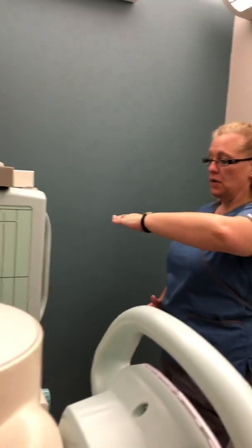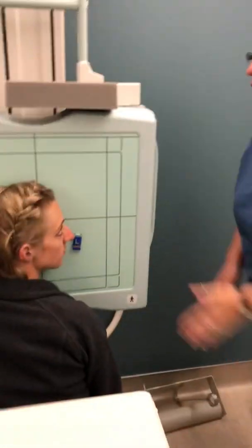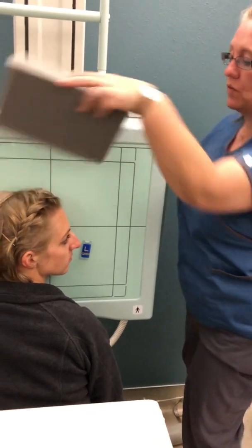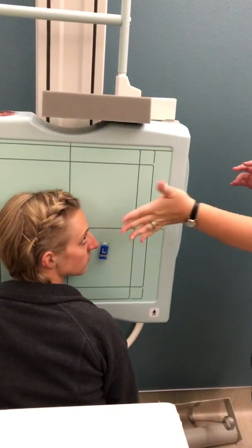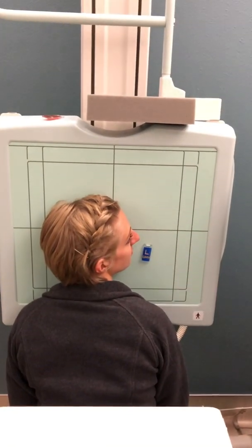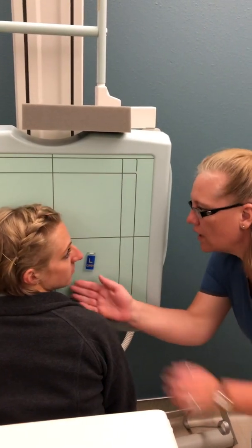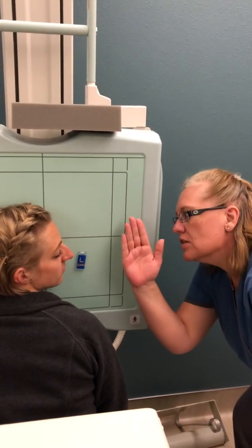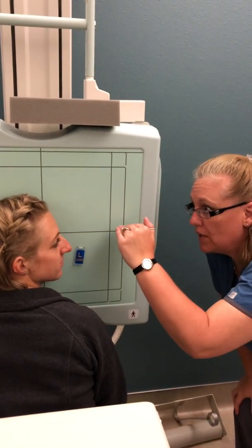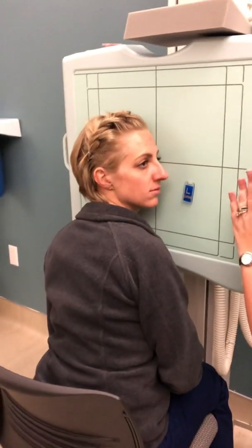We also want the interpupillary line to be perpendicular. I can tell right now that her midsagittal plane is off — so bring your chin down a little bit and turn your nose out towards your shoulder. Now tilt your head this way — perfect. I'm getting her interpupillary line corrected and I haven't had to touch her, because I can give verbal cues.